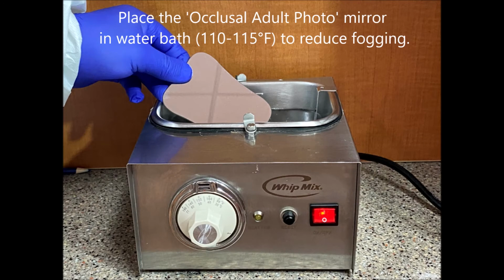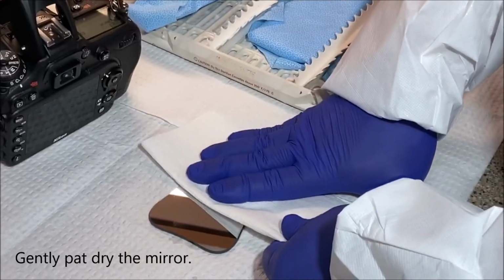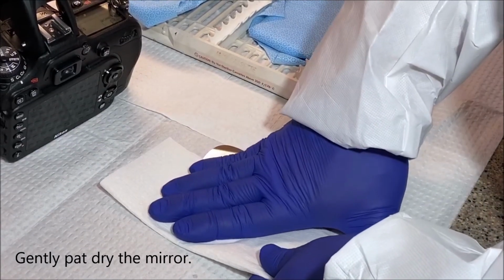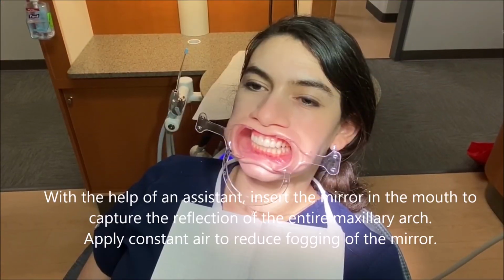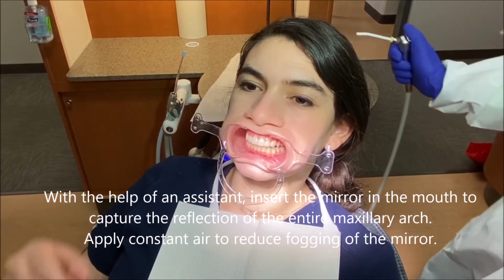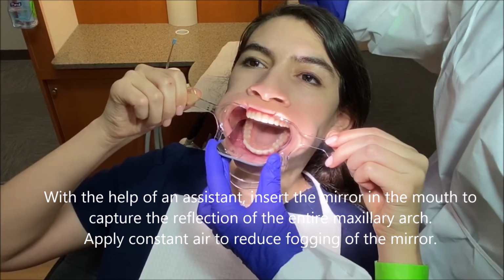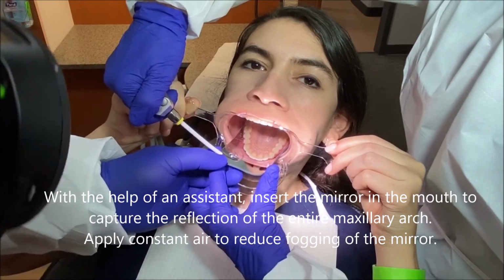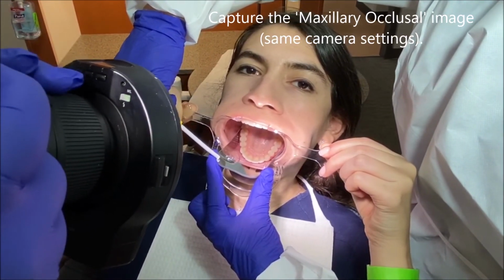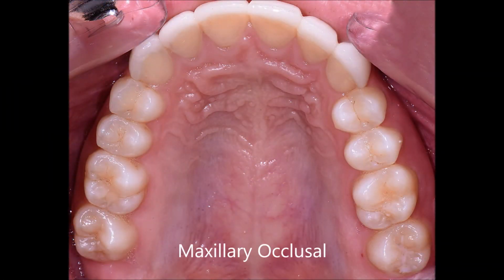Place the occlusal adult photo mirror in water bath 110 to 115 Fahrenheit to reduce fogging. Gently pat dry the mirror. With the help of an assistant, insert the mirror in the mouth to capture the reflection of the entire maxillary arch. Apply constant air to reduce fogging of the mirror. Capture the maxillary occlusal image, same camera settings. Maxillary occlusal.